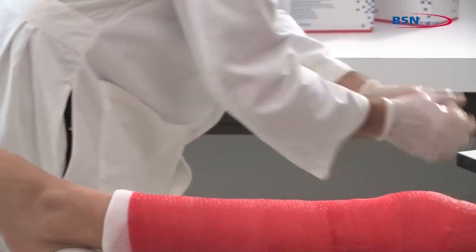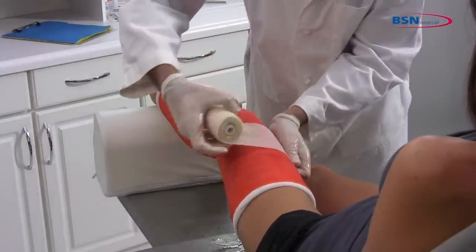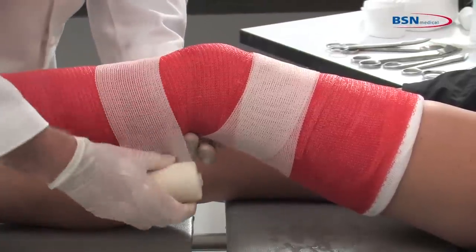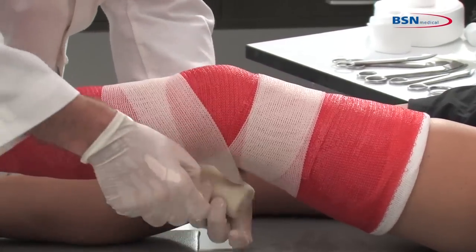Take a third roll and start wrapping the cast above the knee and cross distally through the popliteal area, going around the tibia and fibula and back proximally through the popliteal area. Then wrap crosswise to strengthen the cast at the posterior side of the knee.